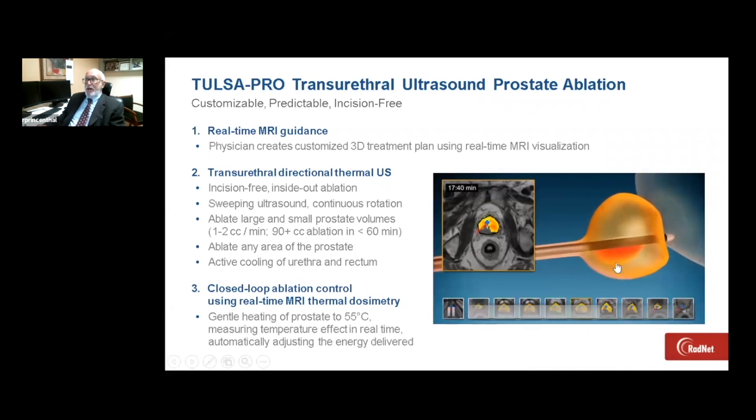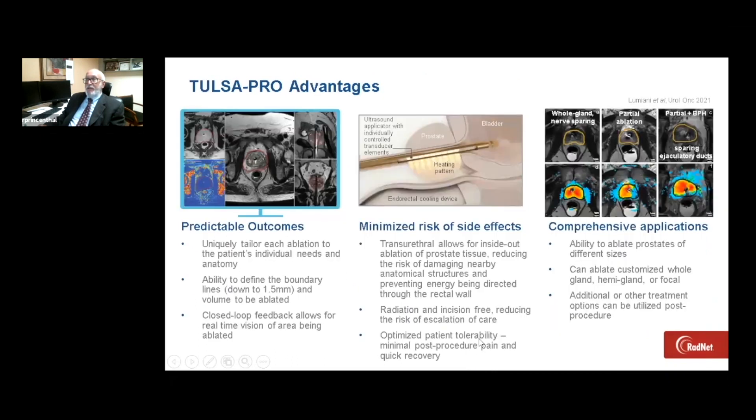This is a sped-up simulation of a real patient. The normal treatment volume and times take about 30 to 50 minutes. At the conclusion of the treatment, we do a post-contrast exam to prove that the tissue has been ablated.